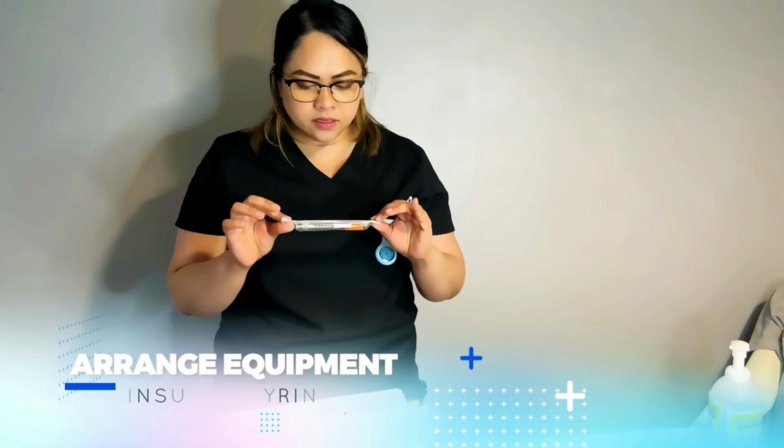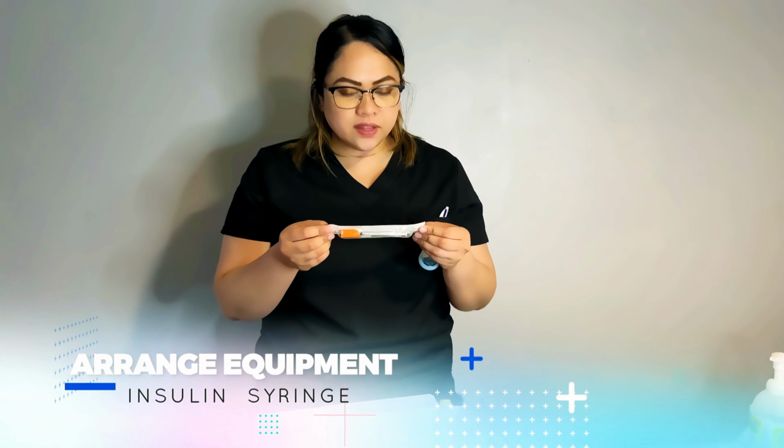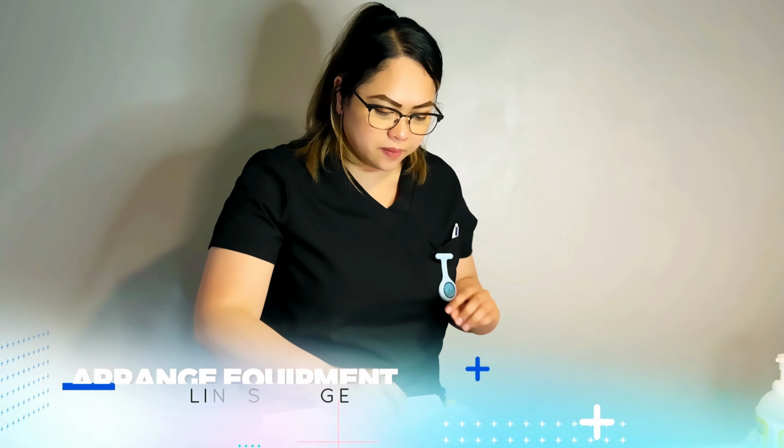The next one is the insulin syringe. So I've got here my insulin syringe. It's clean and intact. The expiration date 31st of the 8th, 2027. Put it in my tray.